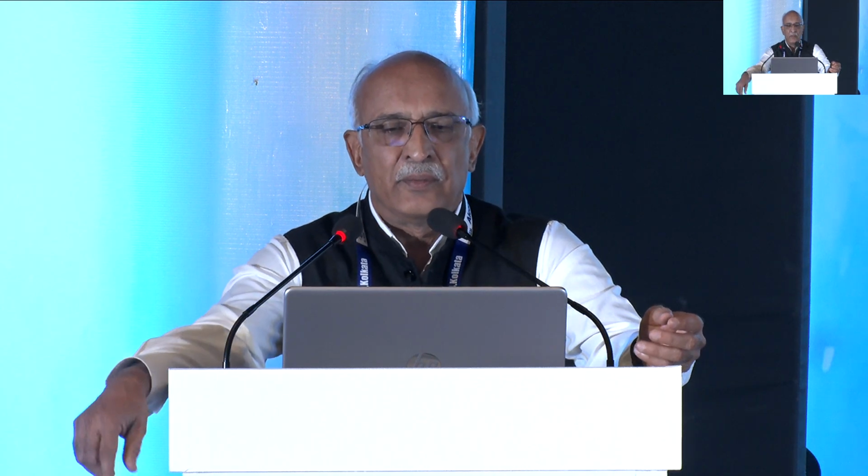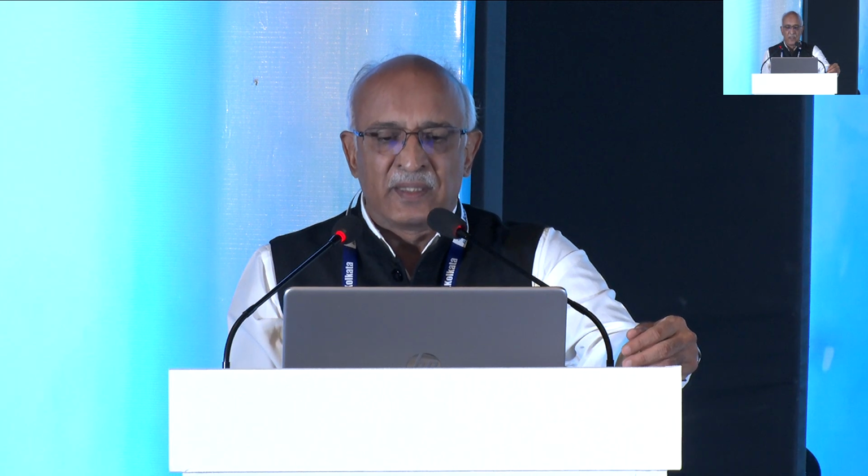But one thing I must say here, especially for the postgraduates, which I learned from Dr. Kumar, is that before cataract formation occurs, before dispersion of vitreous hemorrhage, before vitritis sets in, the best way to locate or to confirm the foreign body presence, the invaluable information that we get, is from indirect ophthalmoscopy. So don't forget, no imaging technique is superior to IDO if you can see the foreign body yourself actually there in the eye by clinical examination.